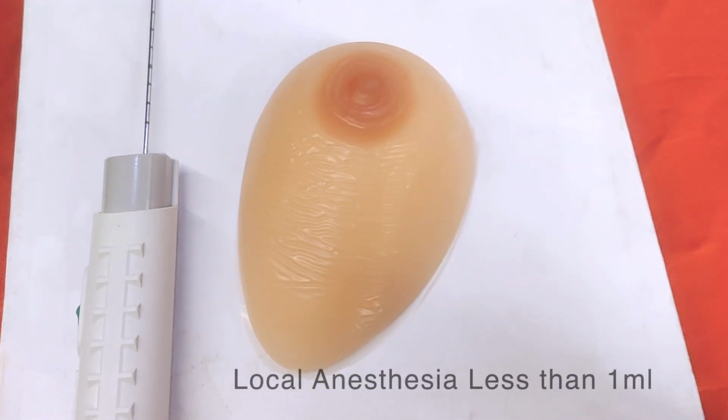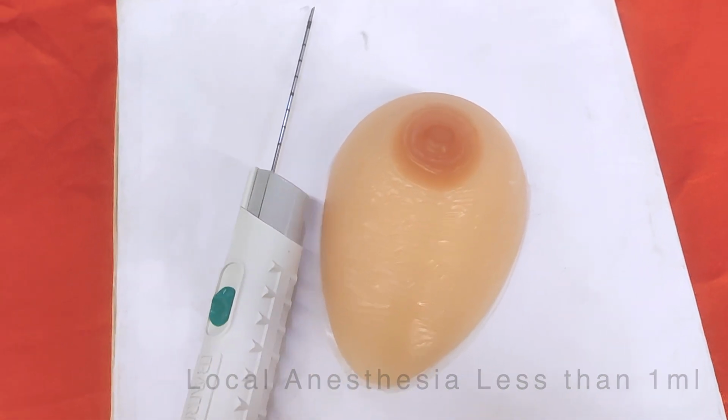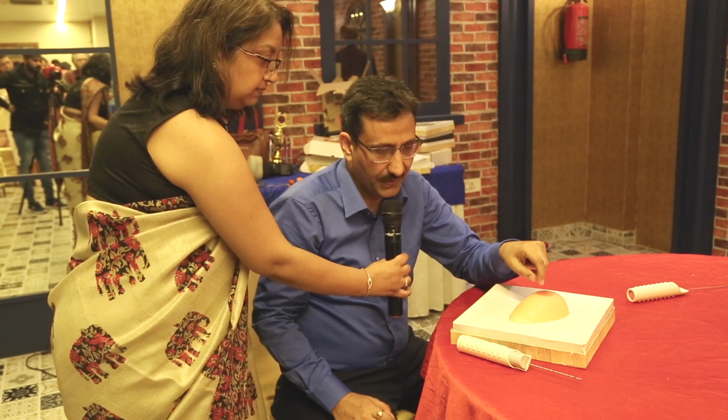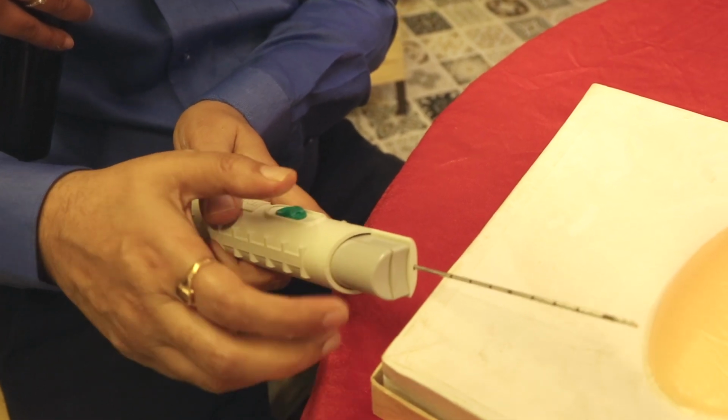Then we will take local anesthesia and infiltrate here. Just less than 1 ml will do. Then we will give a stab to the skin, and then we will load our gun. This is the true cut biopsy gun.